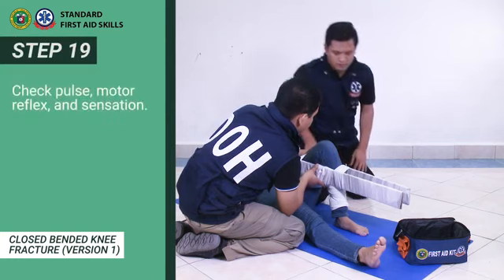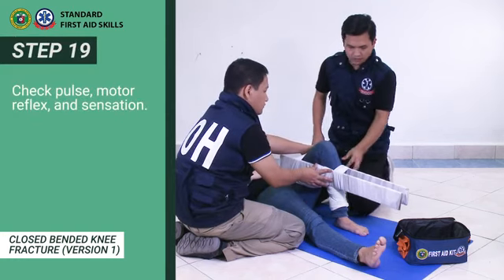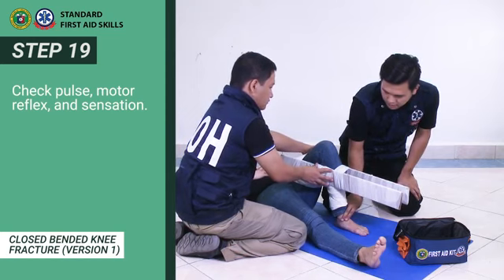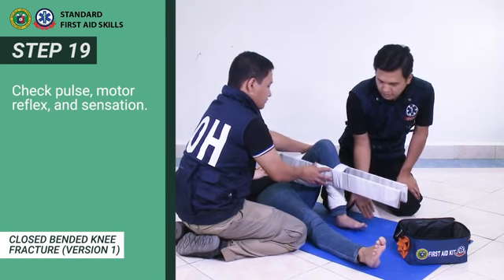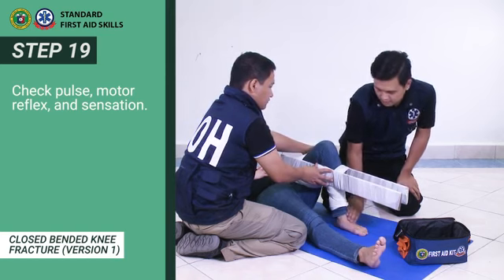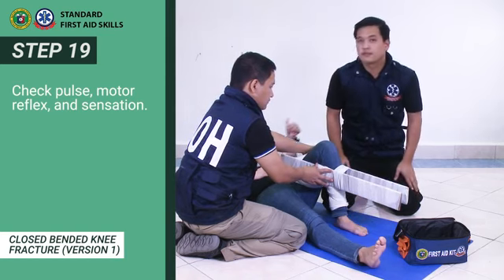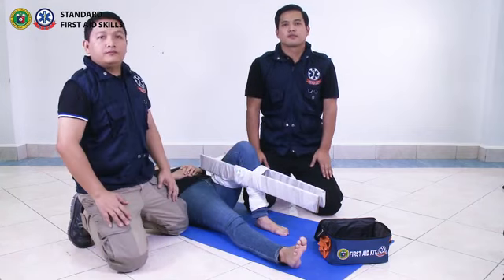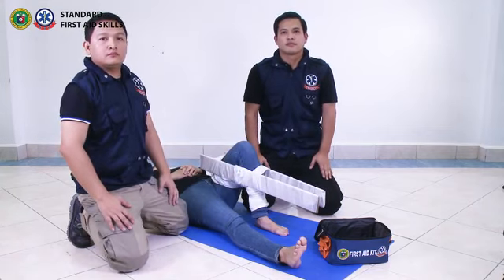Step 19: Check for pulse, motor reflex, and sensation. You have just seen the 19 steps in stabilizing a knee fracture in closed-bended form, Version 1.